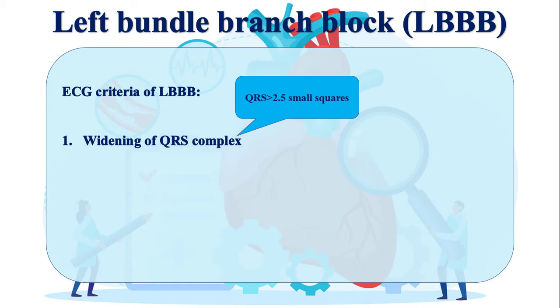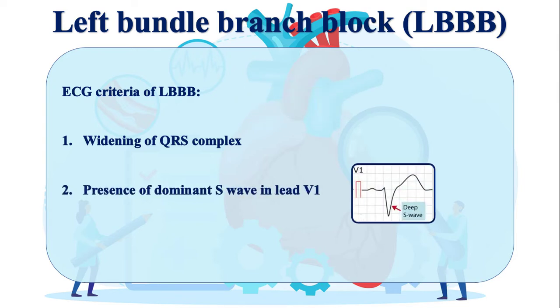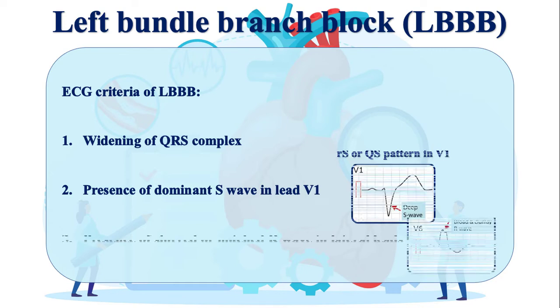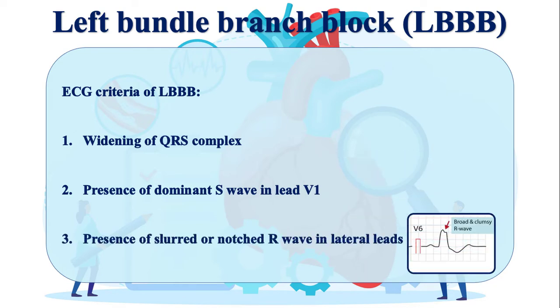The second criterion is the presence of a dominant S-wave in lead V1. Thereby, the QRS complexes may have either an RS or QS pattern in V1. The third criterion is the presence of a slurred or notched R-wave in lateral leads. A slurred R-wave is defined as an R-peak time greater than 60 ms in lateral leads.